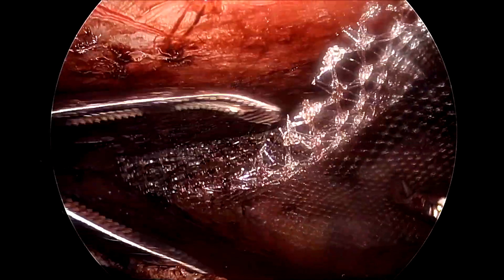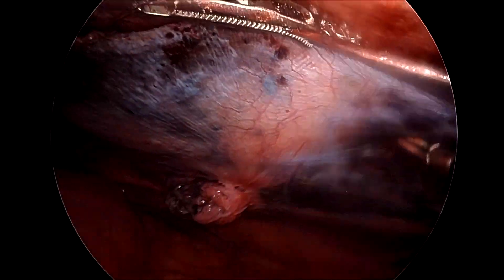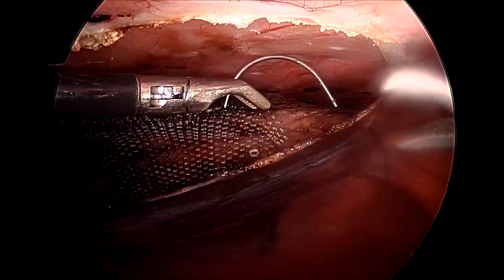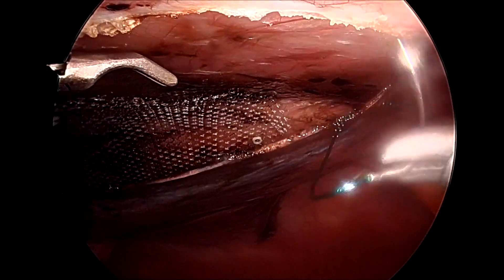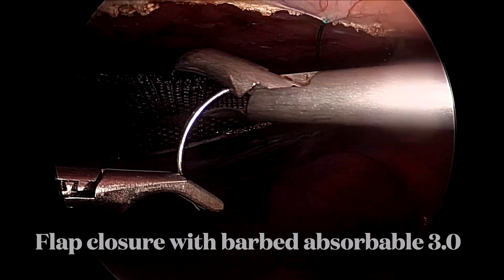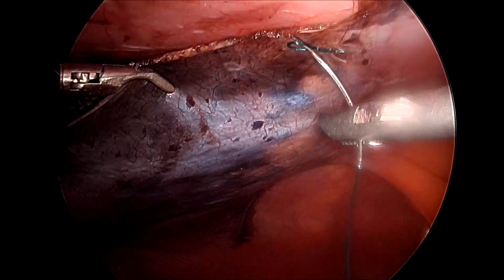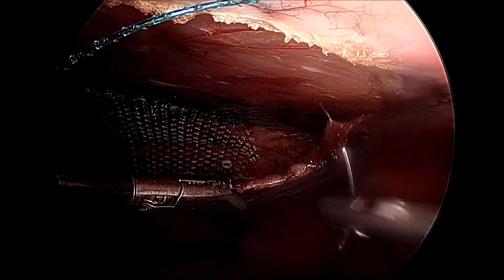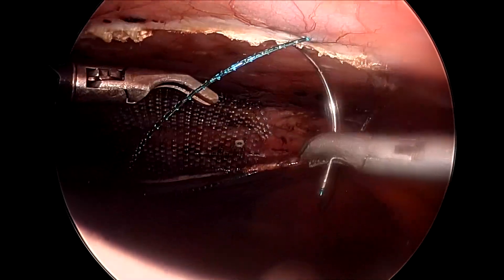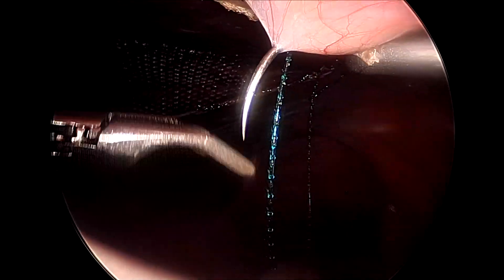It is all about optimum space creation, and if you have created a good amount of space then you can place the mesh perfectly. I have used four-point fixation with the help of tackers in this case, but normally we do not use any fixation. It is a matter of personal choice, and at times four-point suturing, tackers, or transfascial sutures can be used, but we believe there are fewer chances of mesh migration as it is a closed space.